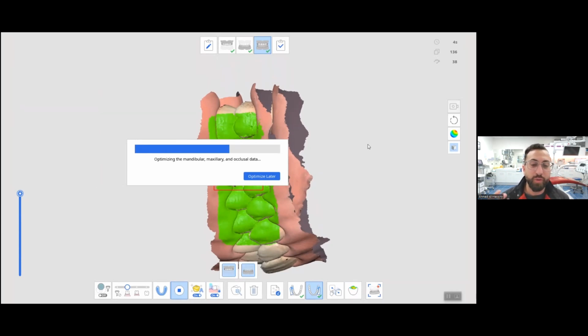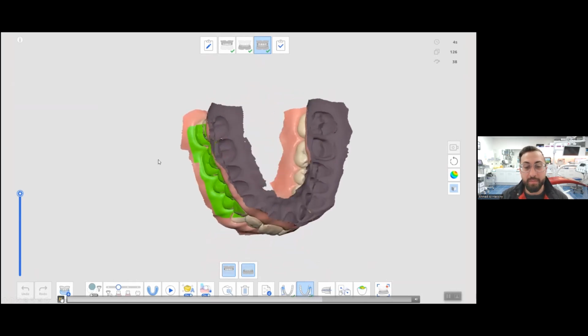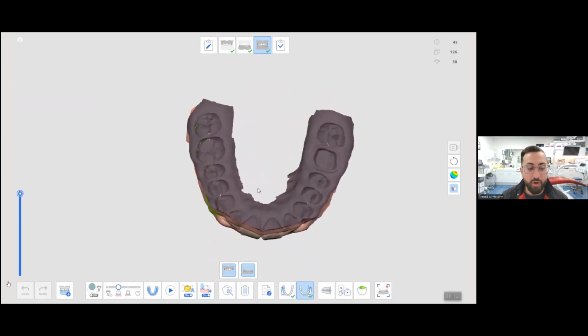And you will see I do a lot of quadrant dentistry, day in, day out. I don't take 2 scans for quadrant dentistry. But whenever I'm working with a lab, it's always a full arch scan, and it's always 2 bite scans, because you're going to see after this optimizes the data, and I did pause the video, guys, it doesn't take this long. After it optimizes the data, I'm going to swerve around and you can see there's no more intersections.